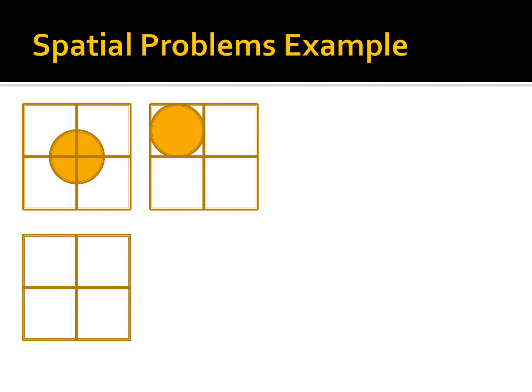If the 1 pixel line were to align exactly with the pixel, it might also be recorded. The chances of this happening are rather low. Chances are better the line would span 2 pixels and be ignored.